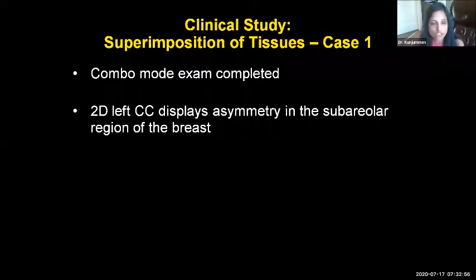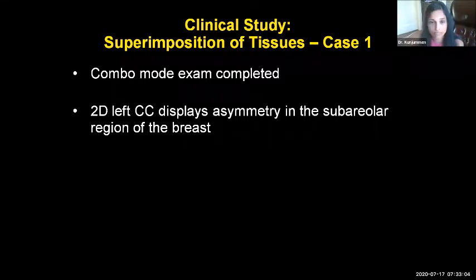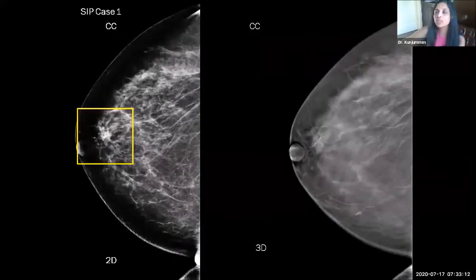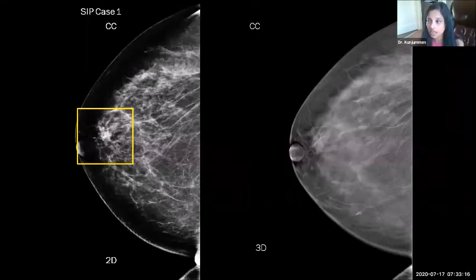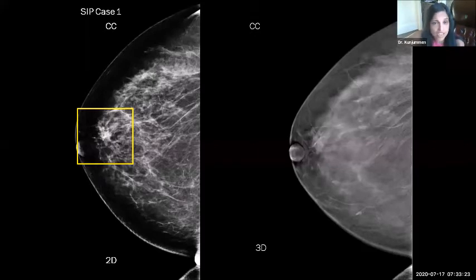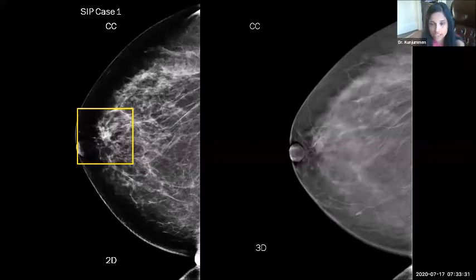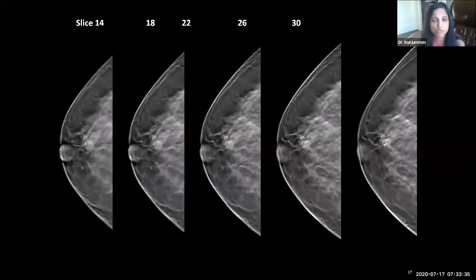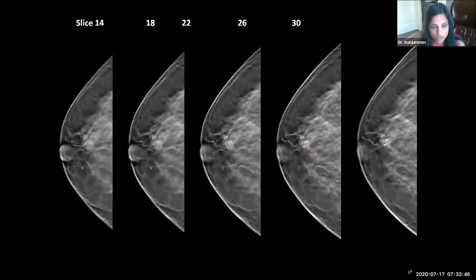Now I'll switch cases to show how tomo helps with recall reduction. Case one involves superimposition of breast tissue. There is an asymmetry in the subareolar region of the breast — it's higher density. Without tomo images, we would have called this patient back. But since we have the tomo images, scrolling through the slices, we can see this is just breast tissue and nothing else. We can dismiss it as just breast tissue and don't have to call this patient back. That is how we reduce our recall rate.